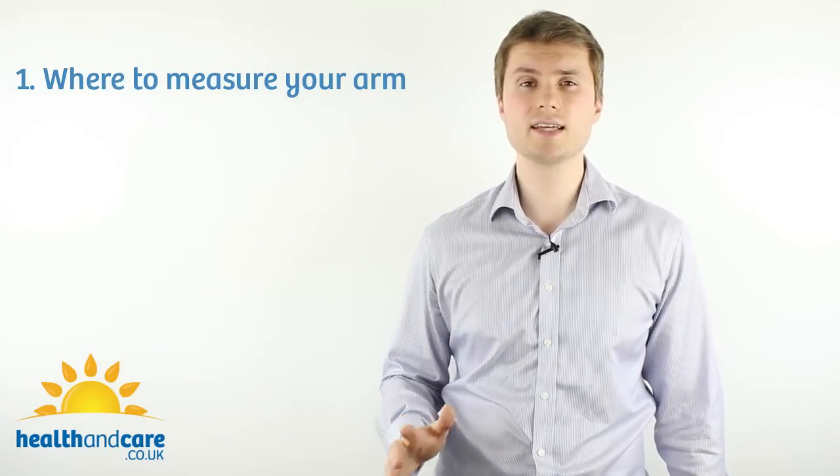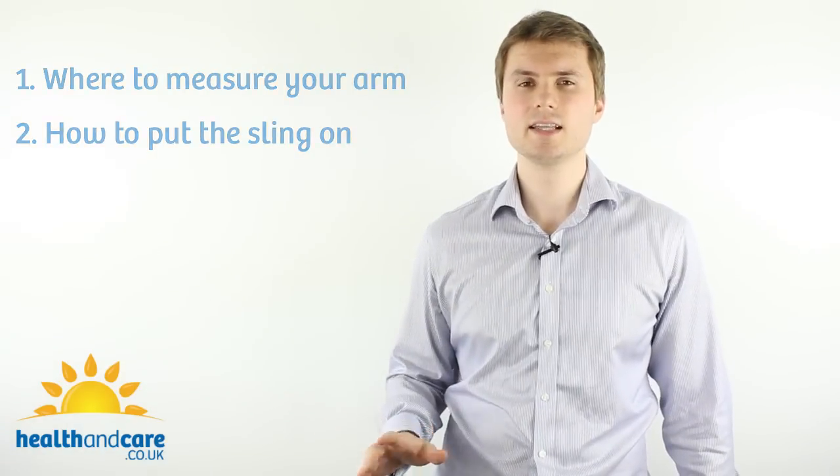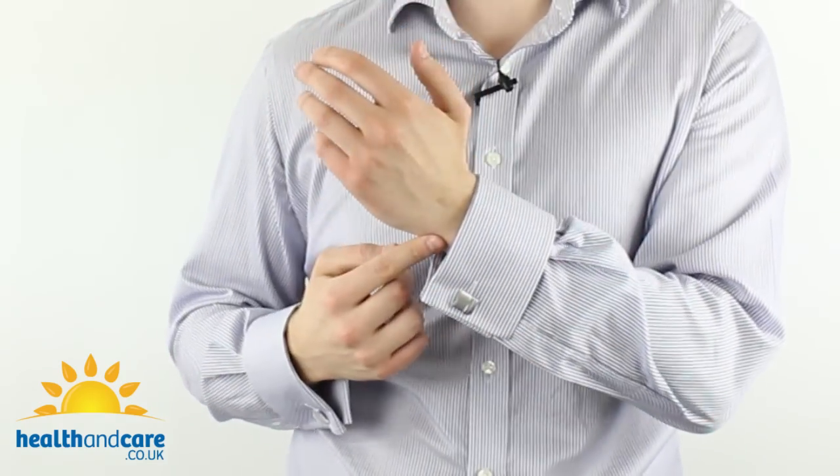I've taken the Cotton Arm Sling off so I can show you two things. The first is how to get the right measurement of your arm and the second is how to put the Cotton Arm Sling on, which is a little bit more tricky. The first thing, which is the easier of the two, is to take the measurement from your elbow to your wrist.